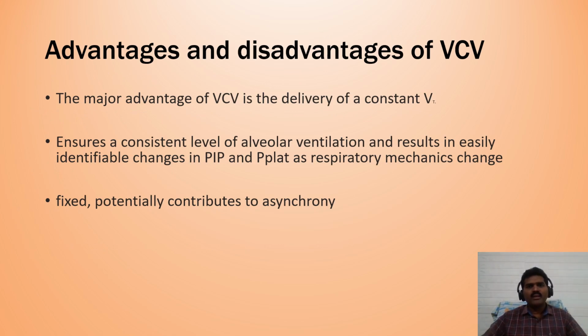Advantages and disadvantages of VCV. The major advantage of VCV is the delivery of a constant tidal volume, so volume trauma is minimized. It ensures a constant level of alveolar ventilation and results in easily identifiable changes in peak inspiratory pressure and plateau pressure as the respiratory mechanics change. Fixed flow potentially contributes to asynchrony. The volume is fixed, and it can contribute to patient ventilator asynchrony.